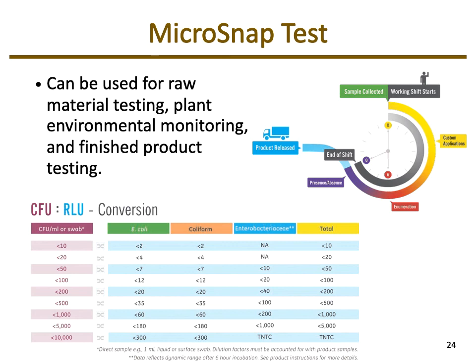So again, this is extremely valuable because you would know before the product has even left whether the material it started with, or the samples during the process or the finished product, could be released or whether there are issues with it.